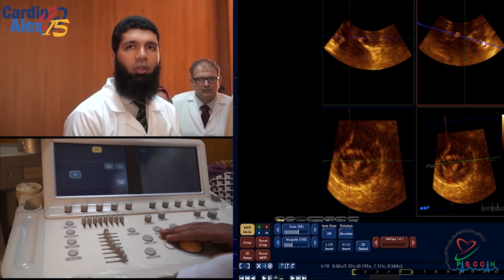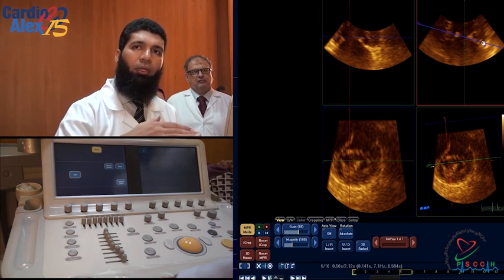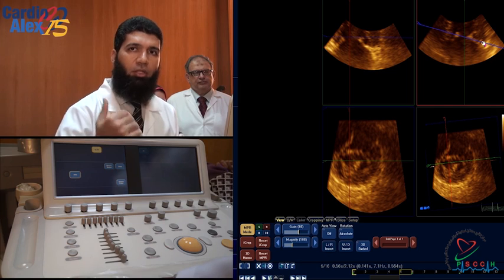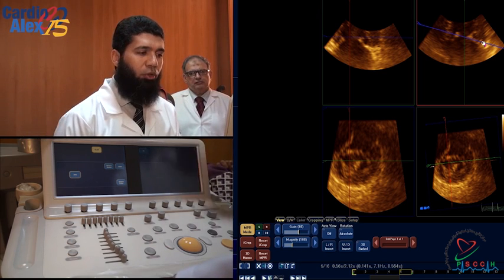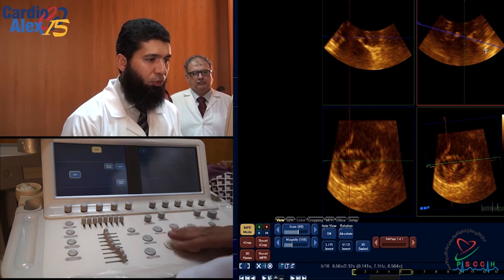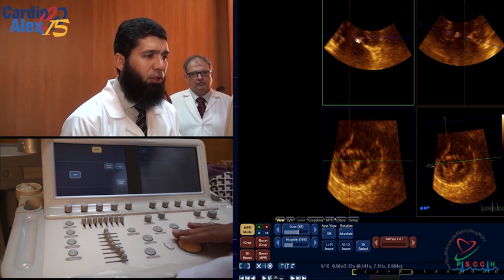The more the mitral valve is stenotic and rheumatic, the more its opening will be planar, will be flat. The less stenosed mitral valve will not be that flat in order to have it in one plane of imaging. So here, if you look at the short axis view, the mitral valve from down, this is the blue box represented by this blue plane.